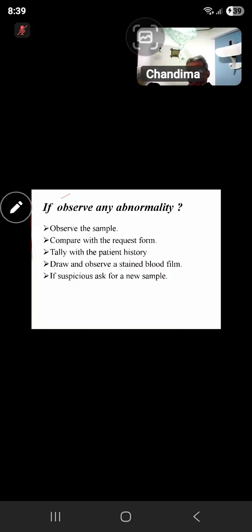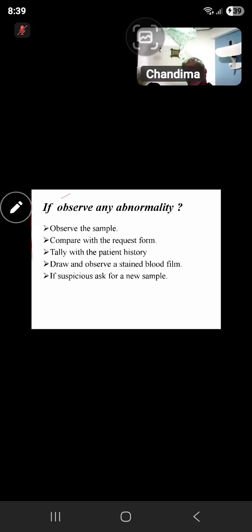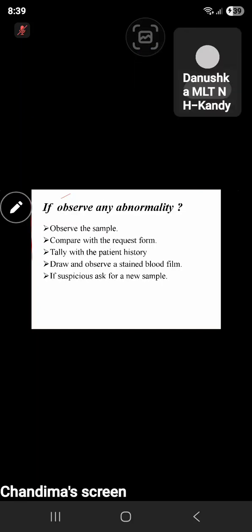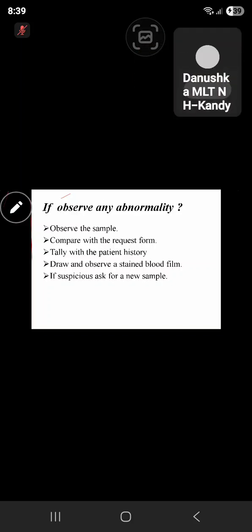Staining property, what would it be? Sometimes background stain can happen. Other than that, the red cells are going to be stained in a pale color. White cells and platelets are not much affected, but the red cells are going to fade in color. Right. Thank you.